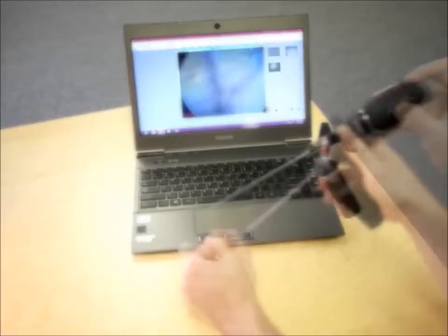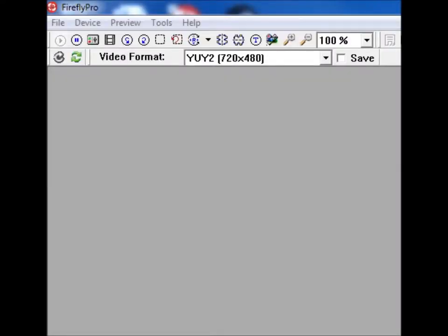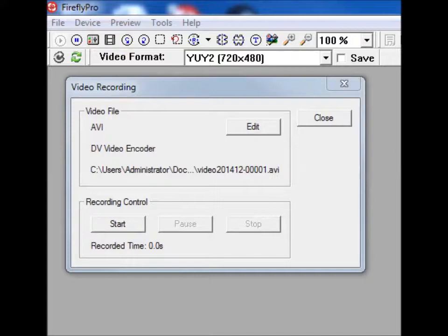If you want to take a still image, click the snapshot button on the device. If you want to take a video, select the filmstrip icon in Firefly Pro and then click start.